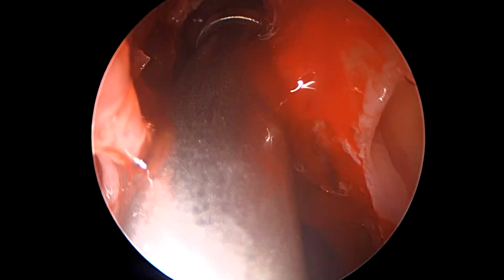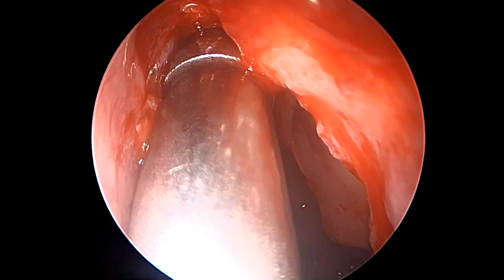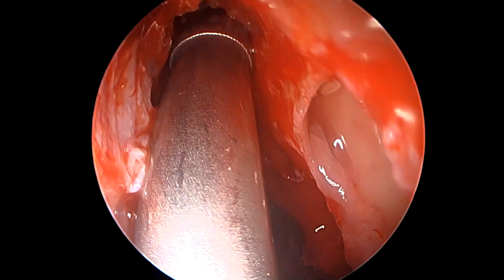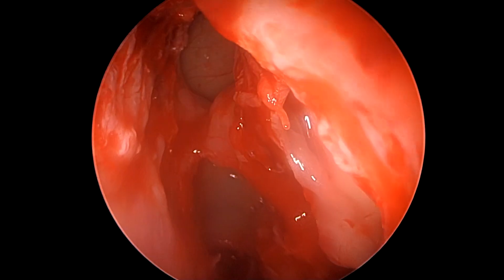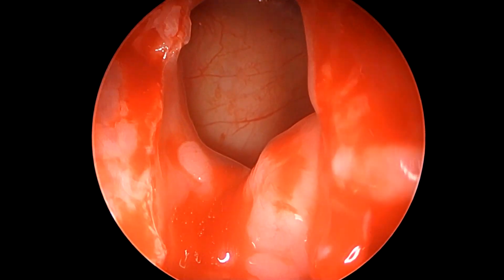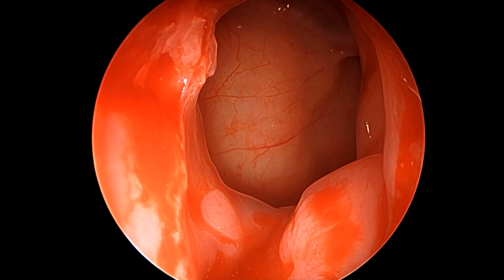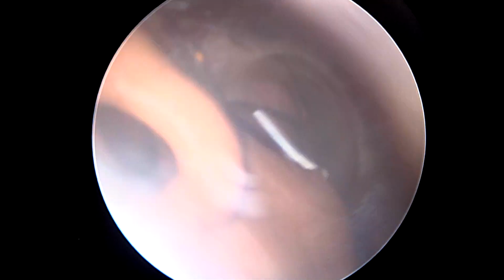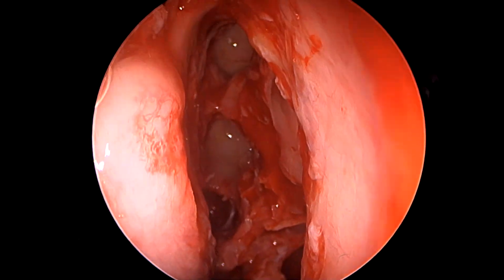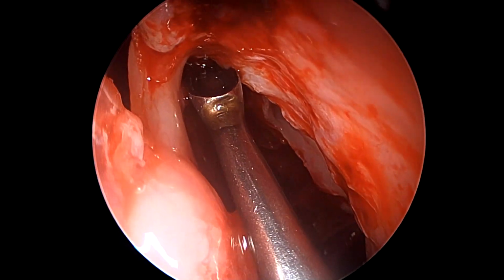And now that we have located the frontal sinus anterior to the suprabullar cell, we have fractured the party wall and converted both these into a common cavity, and then that common cavity can be irrigated as well as controlled in the post-operative period endoscopically. Now you can see that once the party wall between both the suprabullar cell and the frontal sinus has been removed, we can see them in totality as a complete joined frontal sinus. This is the overall picture.